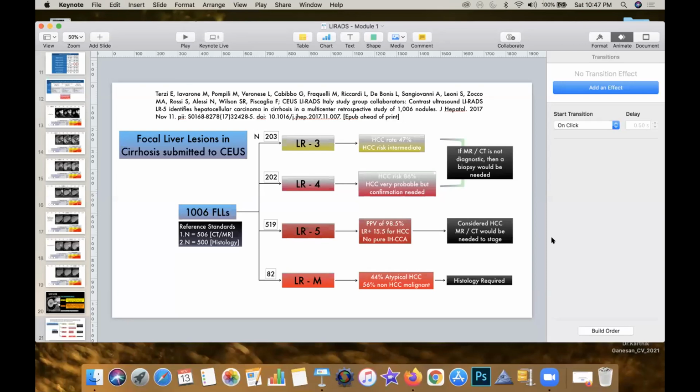The lesion gets contrast on the arterial phase. The background liver is not enhancing. Now, as soon as the background liver gets to the portal venous phase, the liver is going to start to enhance far more, and the lesion is going to go down further. So ideally, what I do is I make an intrinsic comparison with the lesion itself. I don't use the background liver for my washout.